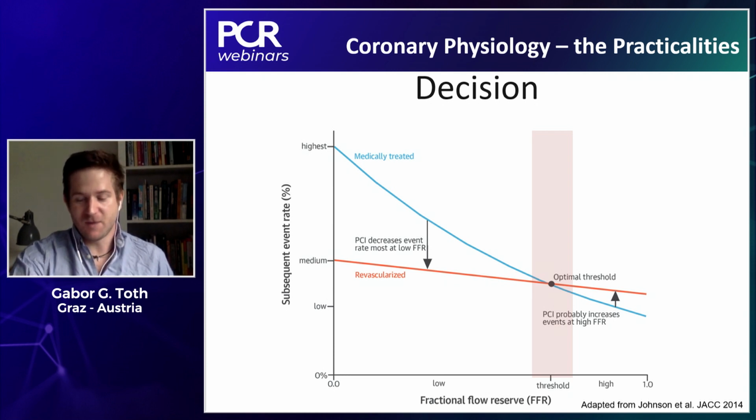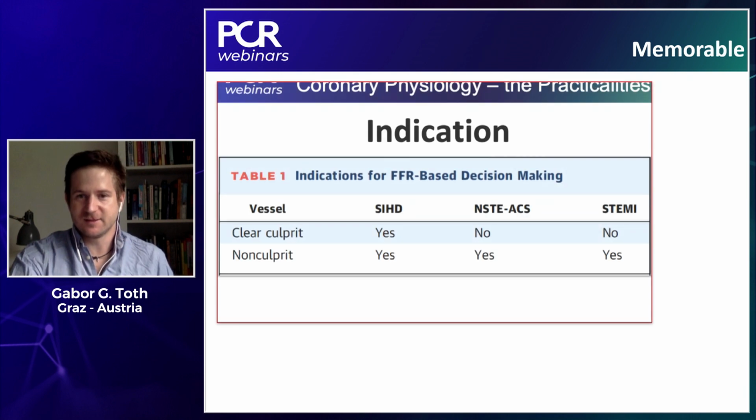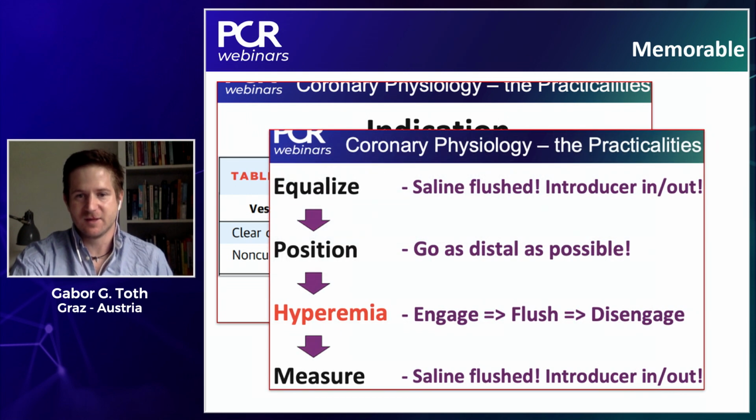So these were my recommendations on the practicalities. And what I would like to just emphasize for you, the indications, remember what are the indications. And second, equalize, position, hyperemia, measure, key steps of reliable FFR measurements.